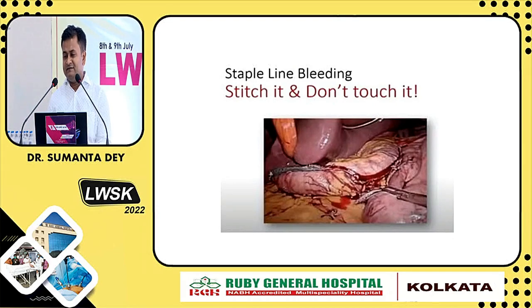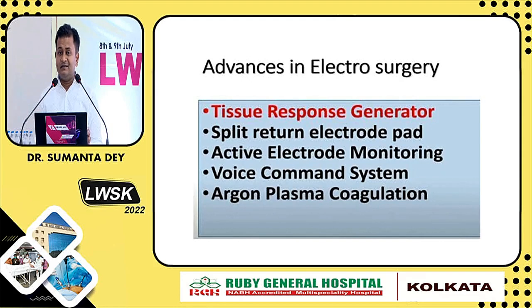Similarly, this is a case of sleeve gastrectomy. Even after sleeve gastrectomy, there can be staple line bleed after staple application. So you don't apply any energy inadvertently. Better to clip it from the bleeding point or put some stitch. There are lots of advances in the electrosurgical area. There is tissue response generator, split return electrode, active electrode monitoring, and voice command system. All these are to avoid electrosurgical injuries and make it more safe. So these are the things you need to know before starting your laparoscopic practicing career.